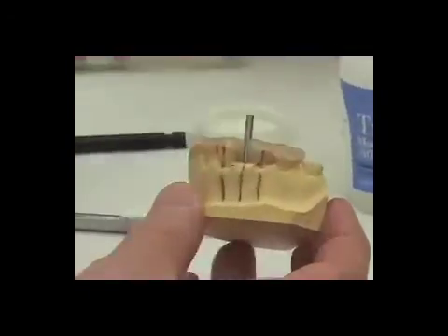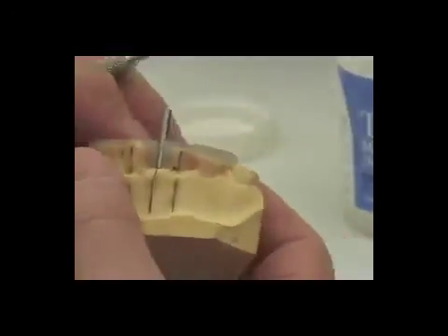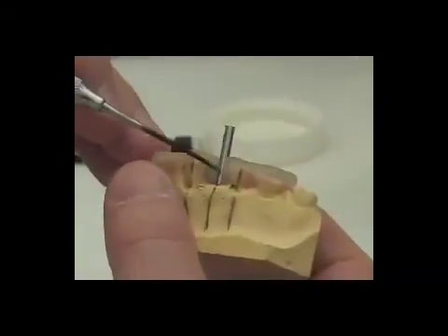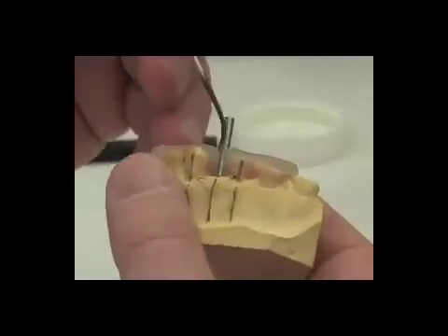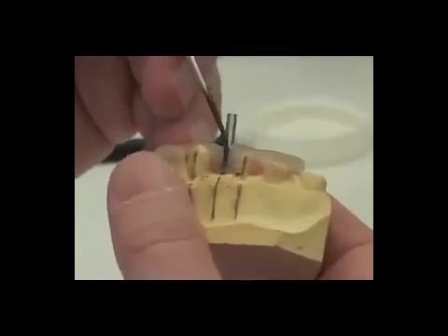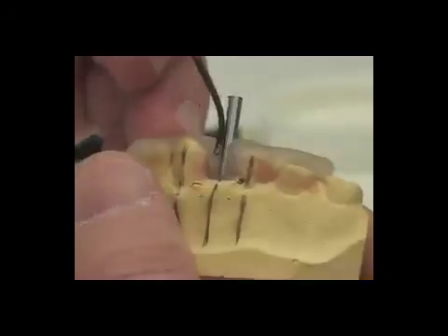We have now adapted the triad material around our 2.8 millimeter drill blank. A nice instrument for getting good adaptation along the length of the drill blank is this fatter, larger PKT instrument, because we can come in and do a very nice job of adapting the uncured triad along the drill blank.